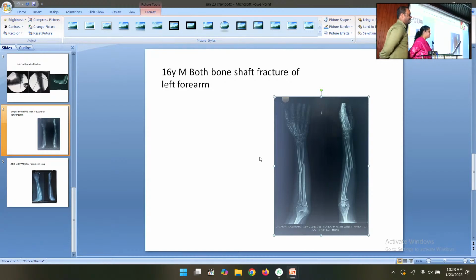Closed nailing. No dissection, so hematoma disturbance is not there. We do not disturb. Surgical morbidity is negligible. Soft tissue involvement is less. Implant removal is easy. Those are 3 points. Okay. But you have to immobilize the limb. That is the disadvantage.